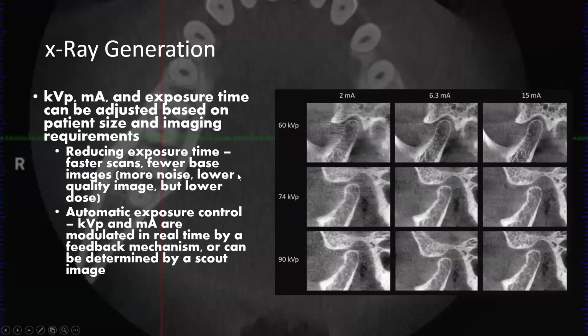And then similar concepts to what I taught you about kVp, mA, all those things, exposure time. That will be adjusted based on the size you use and some of the other settings. You might choose, some of them call it a high fidelity, high resolution setting, and then it's going to have probably a higher mA or a longer time exposure.